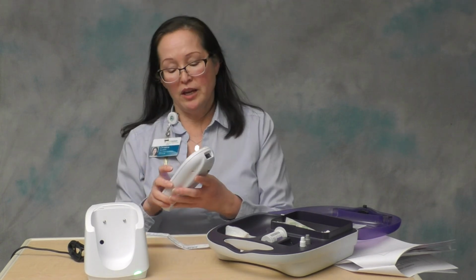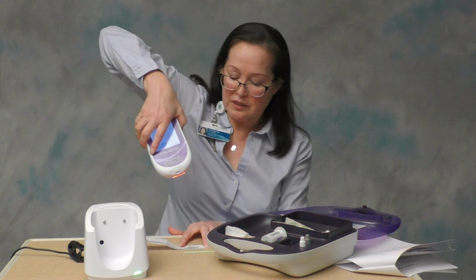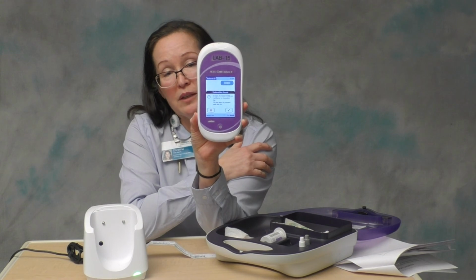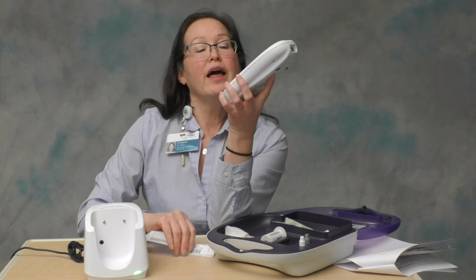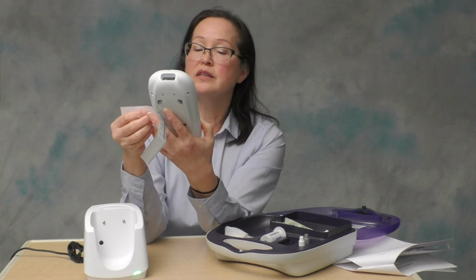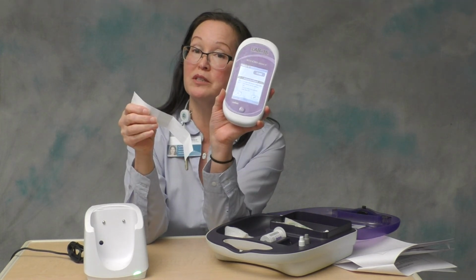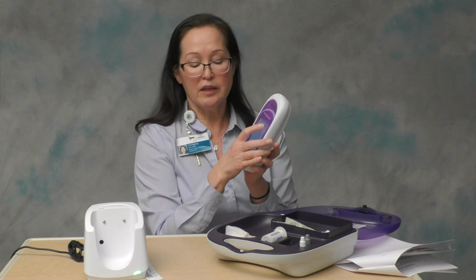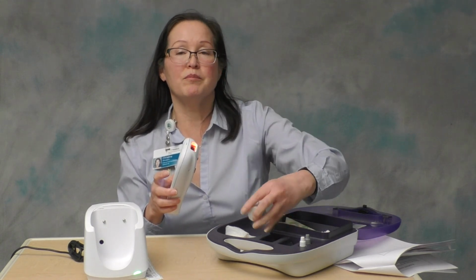I have a fake patient ID band here, so I'm going to scan this, and it's going to give me the message that the patient is not found because this is a fake patient. But the CSN number is displayed there. I'm going to check to make sure that this number on the display matches the number on my armband. Remember, you could see this message in real life if the patient has recently been registered into Epic or has gone in between units. So when I've verified that the number matches the number on the armband, I'm going to hit the green check mark, and then it's going to ask me to scan the strip vial.